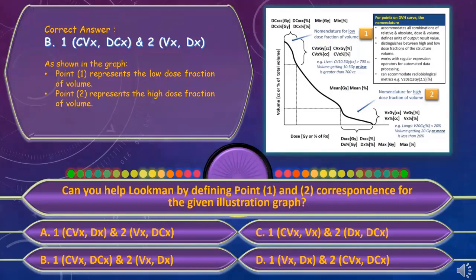Ganga Birth, if you have a question, please just speak it out. First of all, I would like to thank you for such a wonderful and informative talk. I have one query regarding the templates provided by the AAPM TG263 report. Can we utilize these templates in Monaco, or is there any way to convert them into the Monaco TPS? The templates are in XML files, and I think they are easily imported in Monaco, if I'm not mistaken. For us in TBN, we are using Eclipse, and it's easy. I just copy them to the root and then make them a template. I think it's the same because XML is a worldwide used format, so Monaco can communicate easily with XML files. I don't have that much experience. Maybe if Lukman had experience in Monaco, he could elaborate more on this. Okay, thank you. You are welcome.